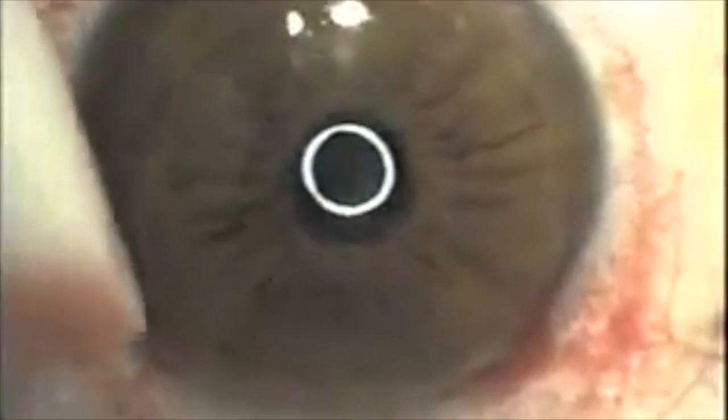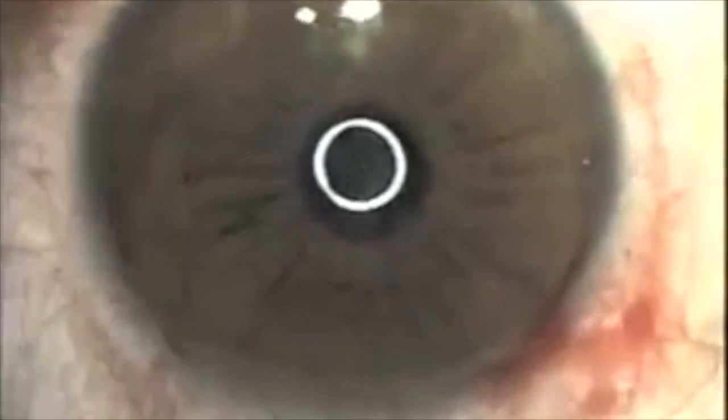It's important to moisturize the cornea as much as you can because the flap might not adhere to the rest of the incised part. So the healing process has just begun. As soon as the corneal flap is replaced, it starts to heal. And your eyes may feel irritated after a few hours, but that's perfectly normal.